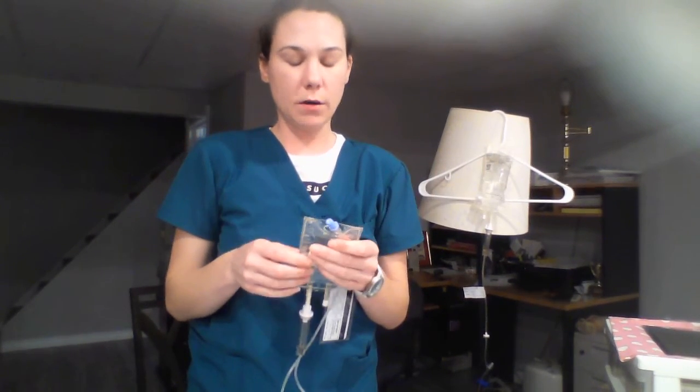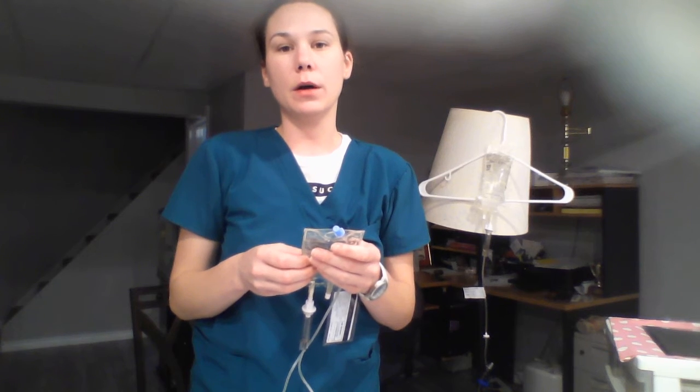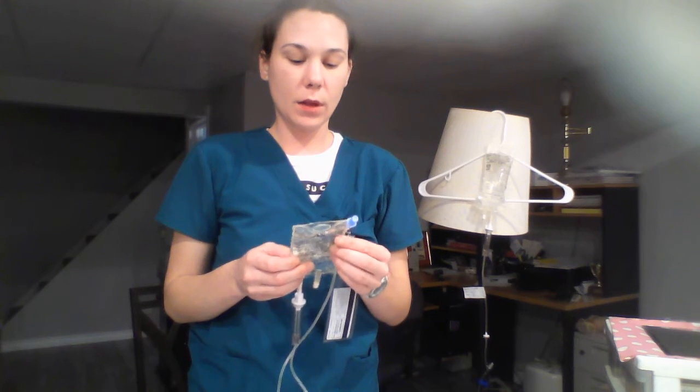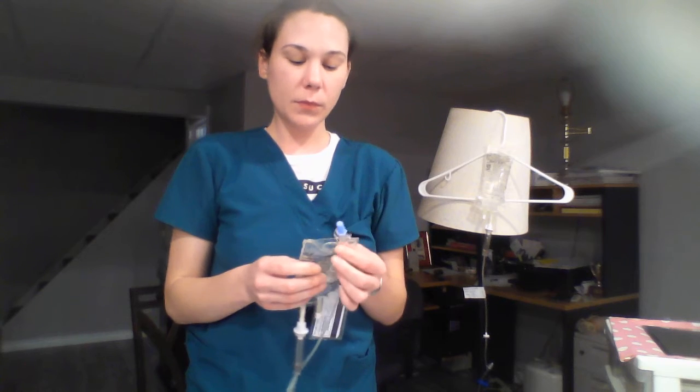So again, going into my patient's room, I've already introduced myself, but I'm going to now explain the procedure that I'll be hanging a secondary line. I also want to do an environmental scan at this point, making sure everything is in working order, O2 and suction. I want to make sure the bed is locked, rails are down, free of clutter.